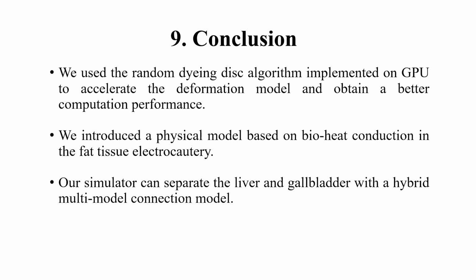This is conclusion of our work. We used the random dyeing disk algorithm implemented on GPU to accelerate the deformation model and obtain a better computation performance. We also introduced a physical model based on bioheat conduction in the fat tissue electrocautery. Our simulator can separate the liver and gallbladder with a hybrid multi-model connection model.